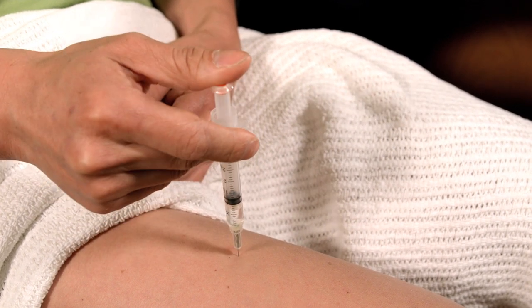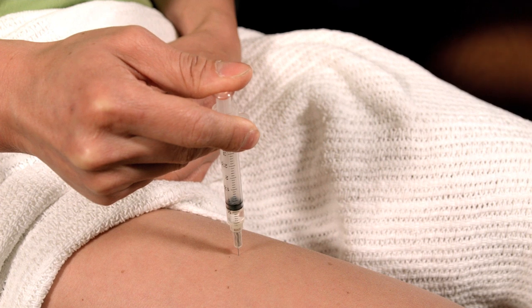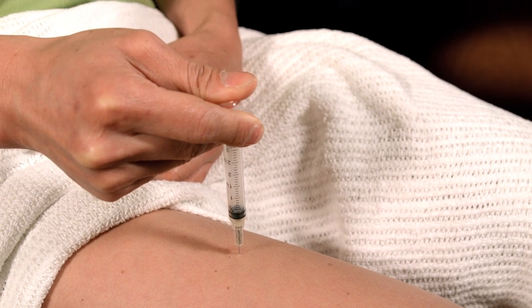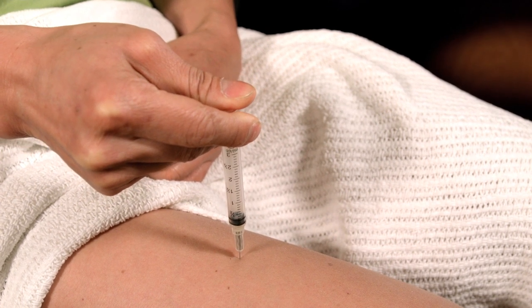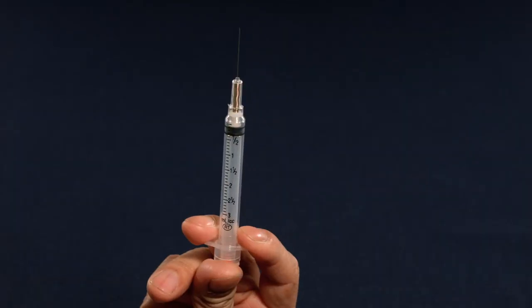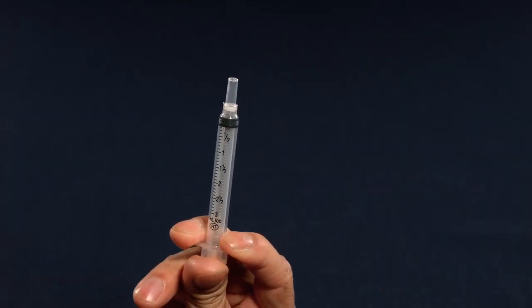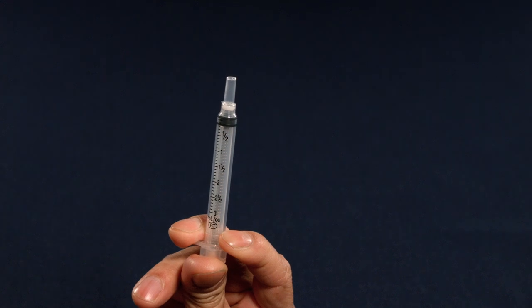Slowly push the plunger in fully until all the liquid has gone. Keep your thumb on the plunger whilst you gently withdraw the needle. Push the plunger again firmly. You will hear a click as the needle springs back into the syringe.